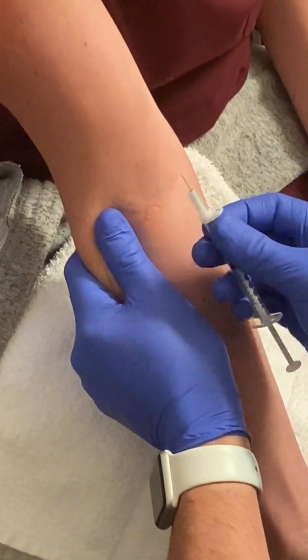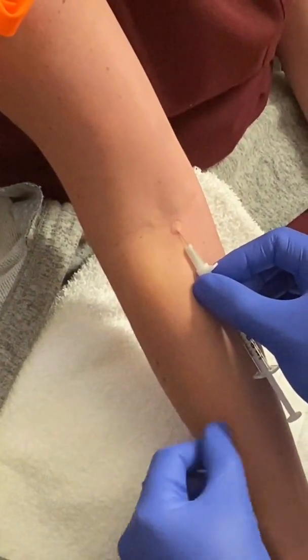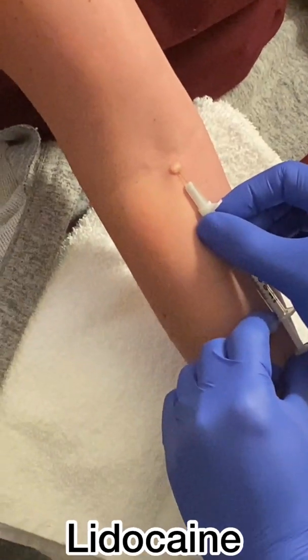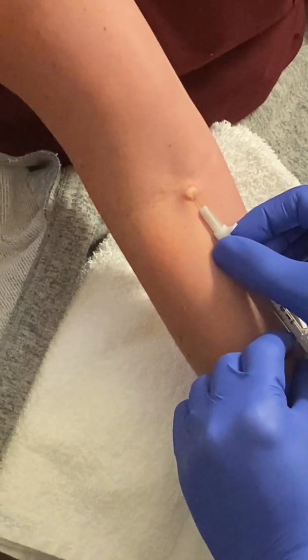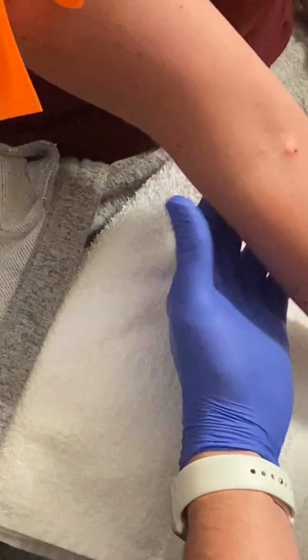Take the needle, bevel up, and I just make it barely beneath the skin like this. And I do what's called tenting. Tenting is to lift up on the needle, and you'll see it slowly bubble up like a PPD. And this is lidocaine. Lidocaine will help numb. It makes it easier for the insertion, pain-free, and it makes it where the patient won't tense up. So you can see a nice little bubble there. And only give about 0.2. Within just a couple seconds, the lidocaine has already taken effect.